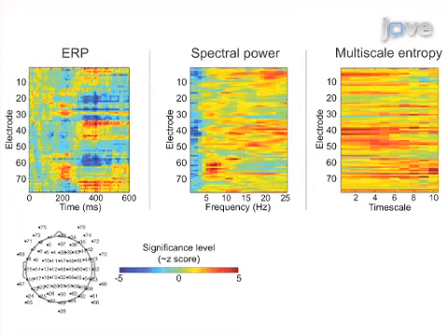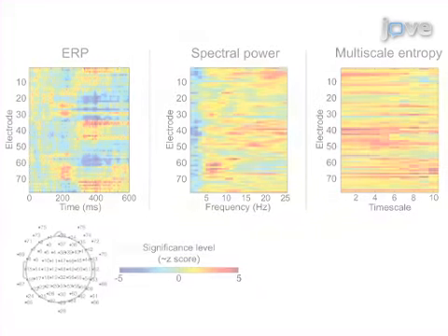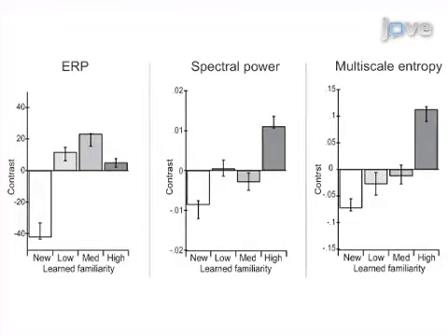The final step is to analyze the statistical significance of the results and interpret the data. This step can be facilitated by using data-driven multivariate approaches like partial least squares analysis. Ultimately, multiscale entropy is used to show how a sequence of changes in the spatial temporal pattern across multiple timescales contributes to specific cognitive operations.